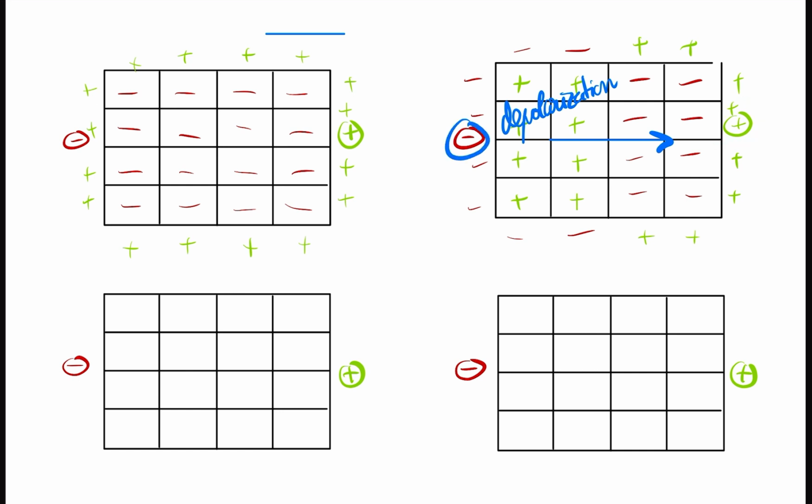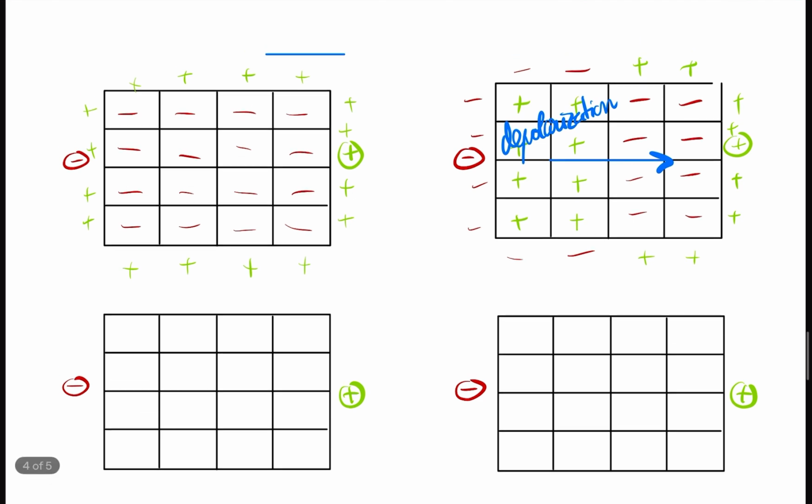Now, what can we see here? What matters are also the electrodes that are outside. If the arrow is from the negative electrode to the positive, then we can see a wave that is going up. So something like that. Or wait, I'm going to draw it prettier. Something like that. If it's the other way around, from positive to negative, it's going to be down, but we will dive into this a little later in this video.